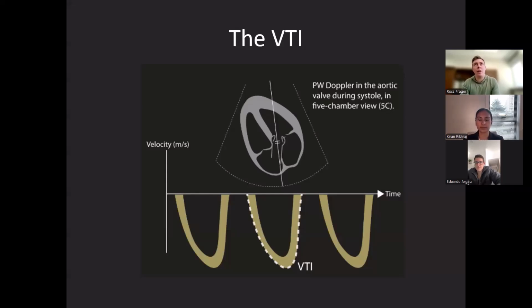And so in my role as a POCUS educator, when I teach ultrasound, the first thing that I teach beyond core lung ultrasound and getting the cardiac views to globally assess for pericardial effusion, LV systolic function and RV function is VTI. I think it's probably the most useful single hemodynamic measure. And as hopefully we're going to be able to demonstrate, you can use it to phenotype patients in shock extremely quickly, and in fact, rule out a lot of life-threatening causes of shock with a single measurement of the VTI if you acquire it adequately.